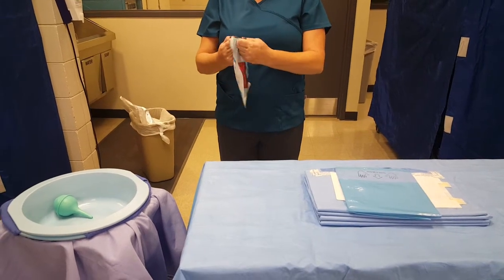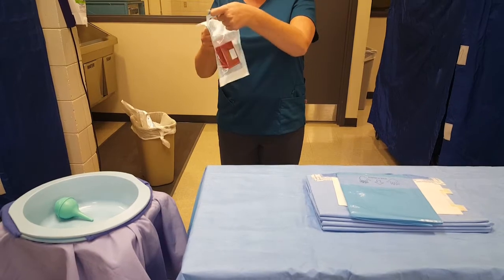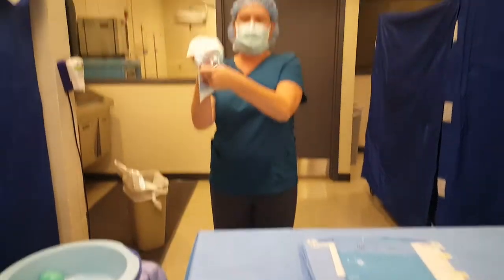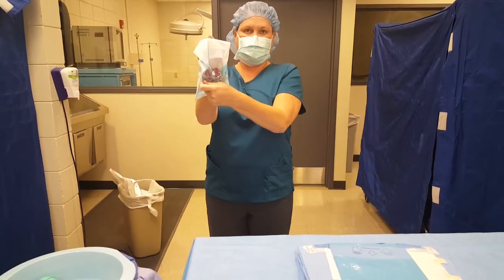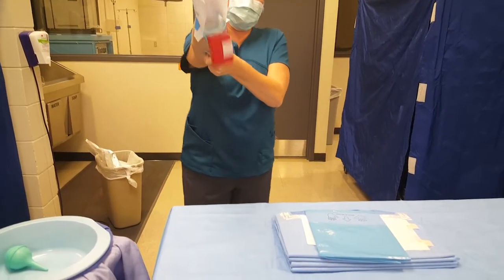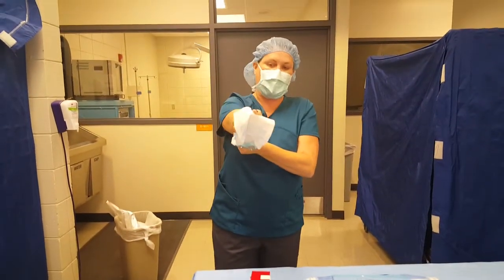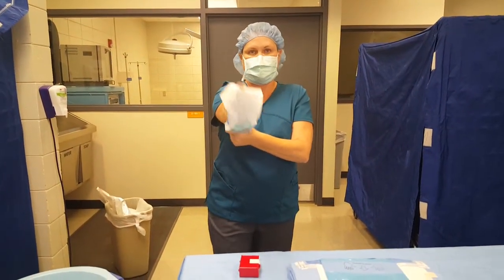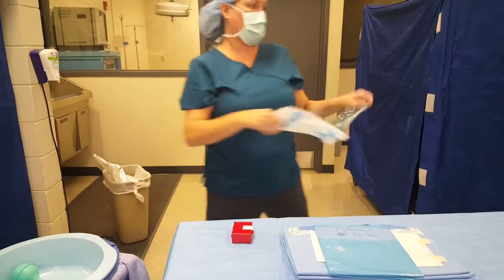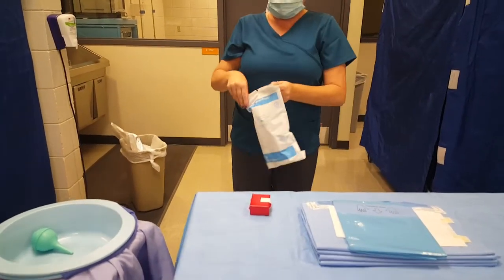The peel and shield method. I'm going to slowly peel it. This time I'm grasping and the paper will be on the top. I'm slowly peeling it away and shielding my arm. Right here, I have it shielded so that I'm not covering the sterile field — my unsterile arm is not going over that sterile field. Here's one more item following that approach.